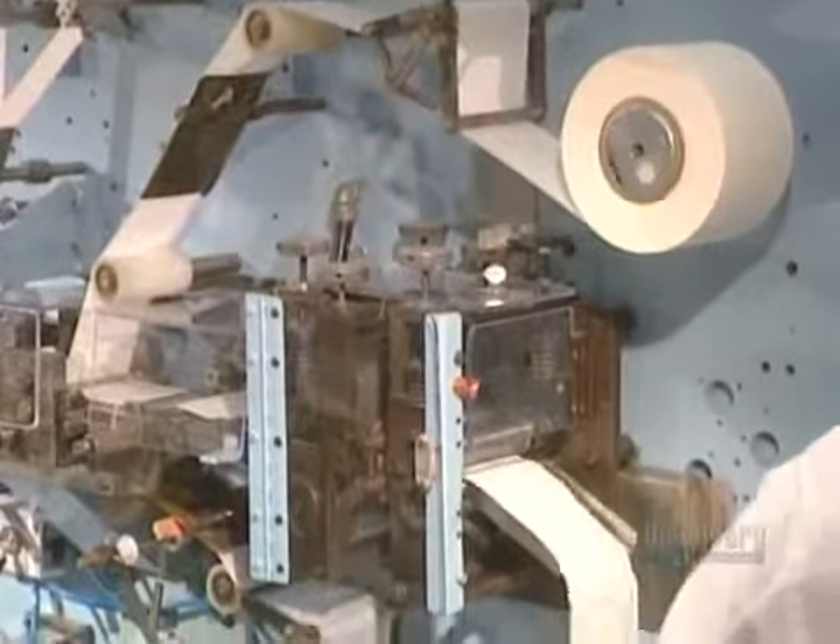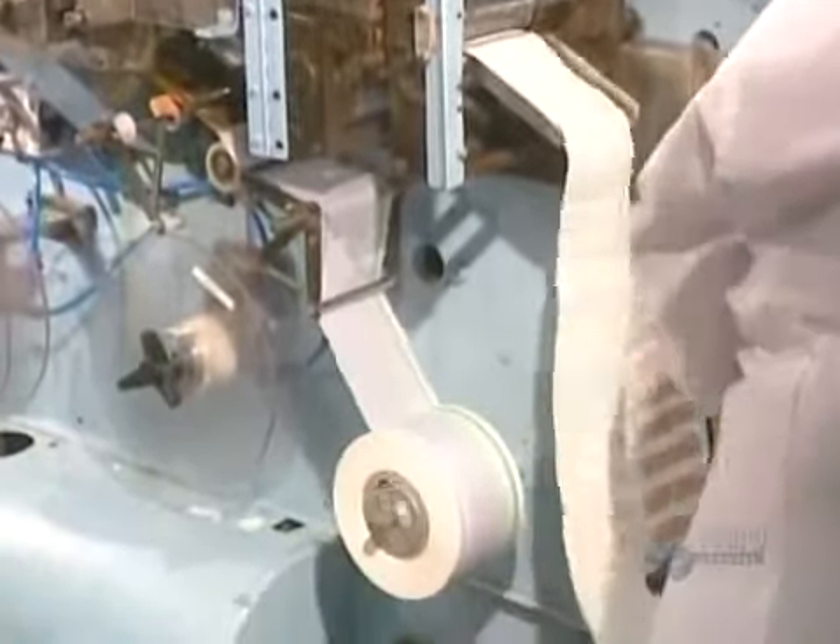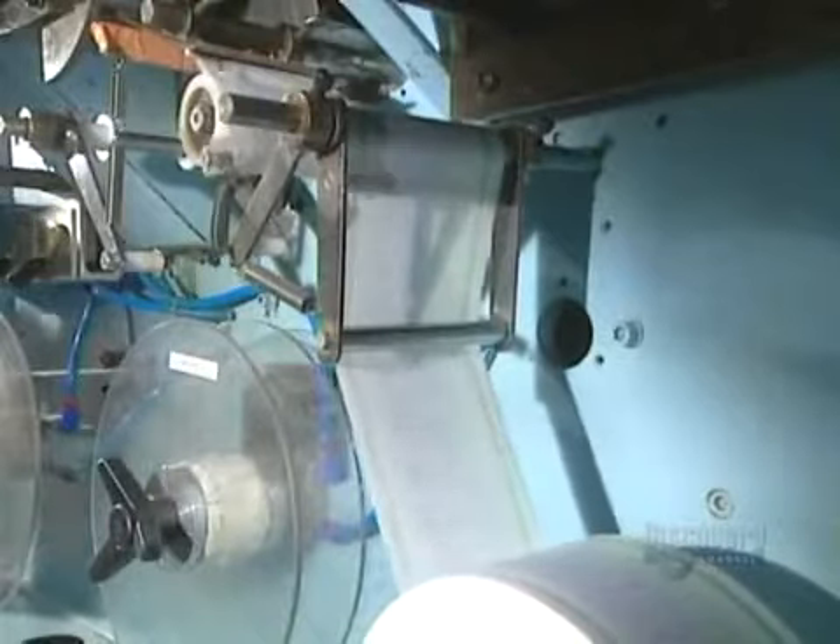The bandages are wrapped one by one. This machine applies the unprinted white wrapping paper which protects the bandages, and now they proceed to packaging. Packaging speed depends on the product, varying between 300 and 1,500 bandages a minute.